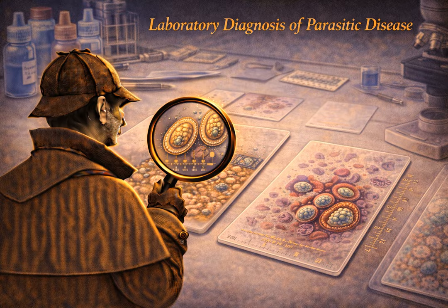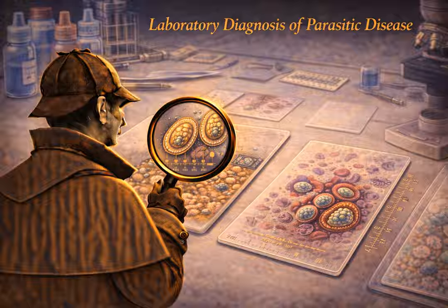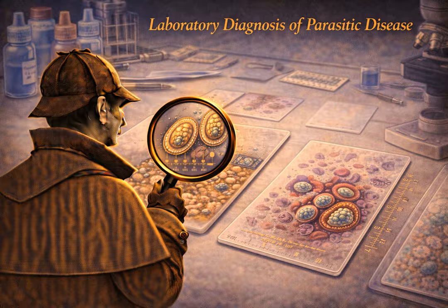Okay, moving into section 7, we're finally stepping away from the microscope, the modern shift to immunology and molecular testing. Yes, this is the paradigm shift from visually hunting for the organism to chemically detecting it. We basically have two main arms here, antigen detection and antibody detection, and they are very, very different clinical tools.